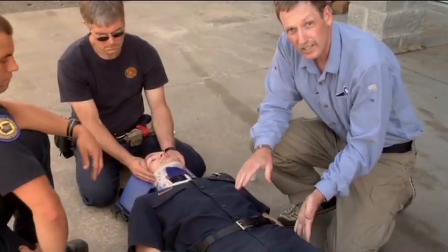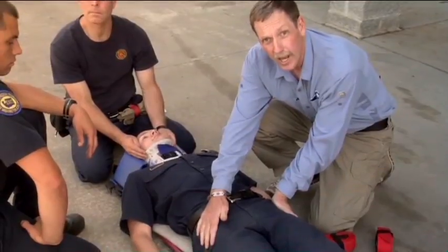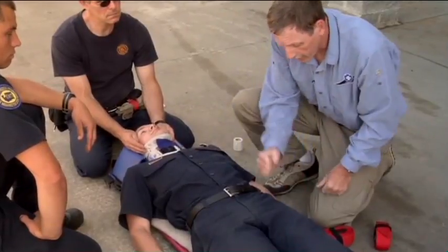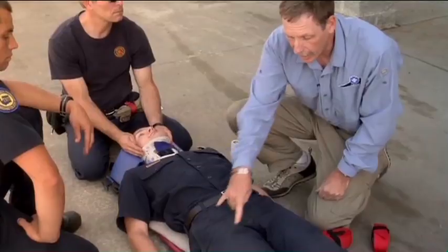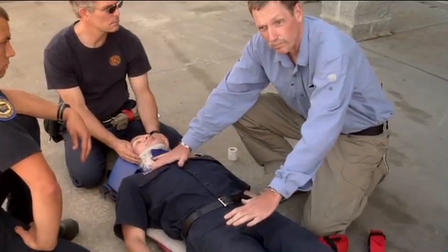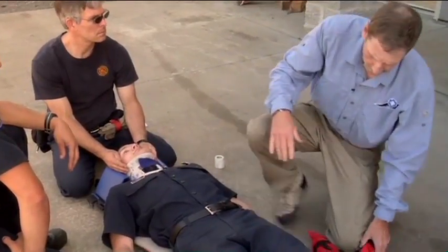We move down to the next weight center of the body and we look at the anatomical structures underneath. We have the wings of the pelvis. The wings of the pelvis we can strap all day long really tight, and so that's what we're going to do. In fact, we're going to have a couple of lateral straps across there, and that's going to weld the upper chest and weld the pelvis, which is both ends of our spinal column, discounting the head.